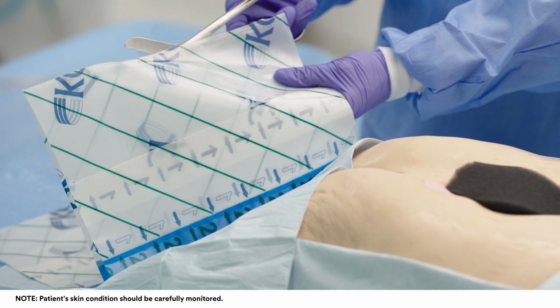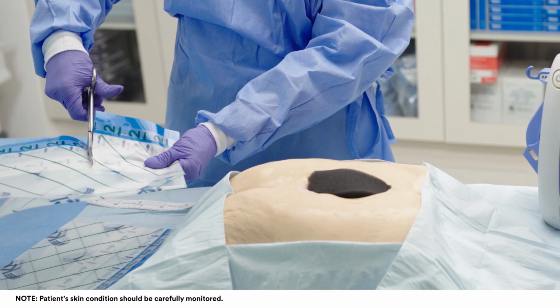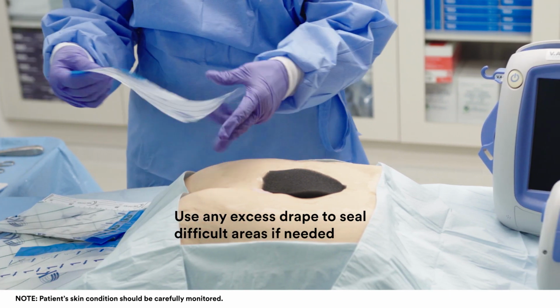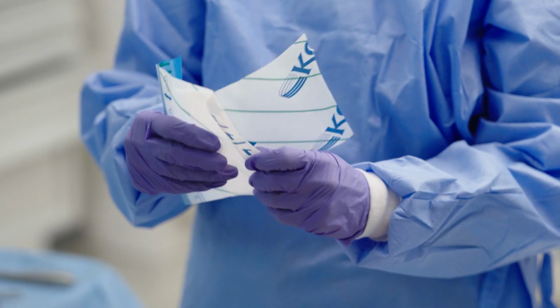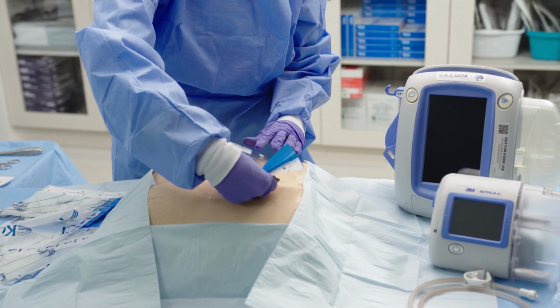Trim the VAC drape to cover the VAC dressing foam and an additional 3 to 5 cm border of intact para-wound tissue. The drape may be cut into multiple pieces for easier handling, retaining a portion of the blue handling tab on each piece. Partially pull back one side of layer 1 to expose the adhesive. Be sure to hold the layer 1 flap back to prevent readherence to the drape.